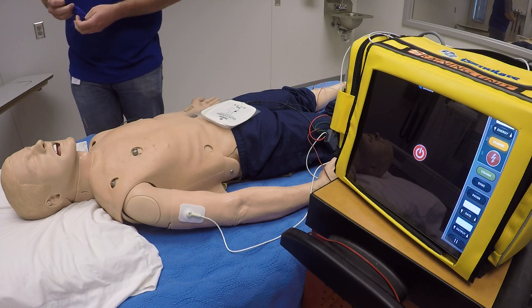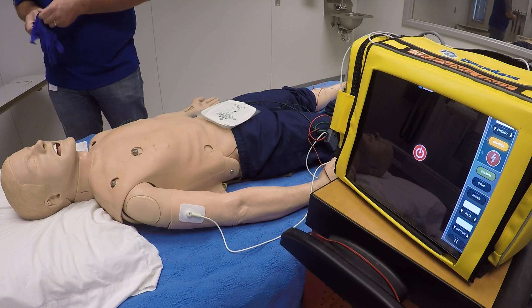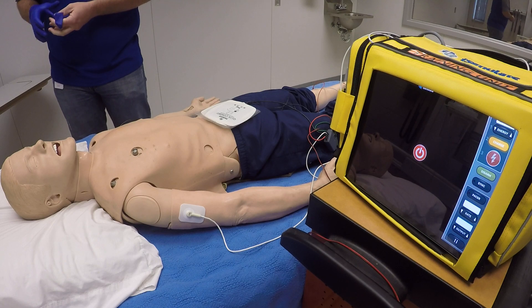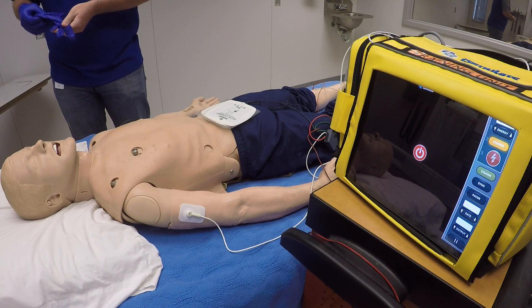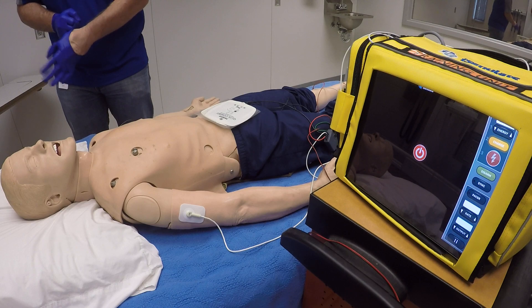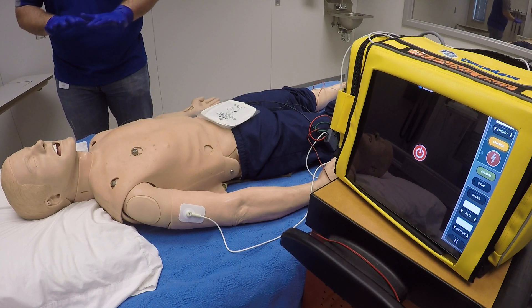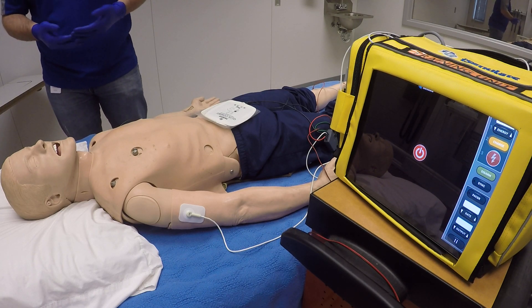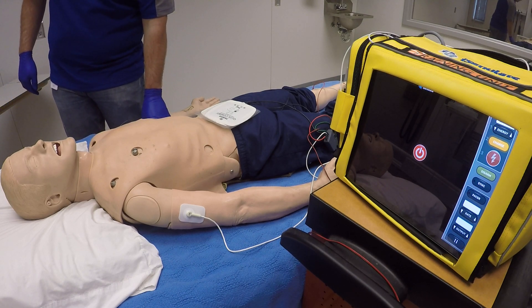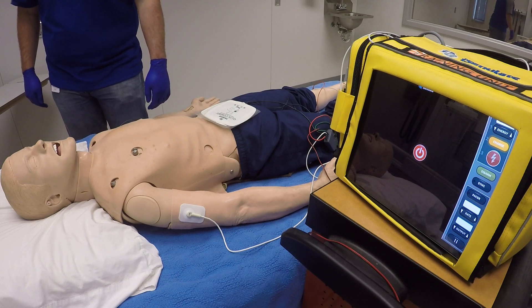We can consider the need for medication to sedate the patient — Versed or Valium or whatever your protocol has. Also, if the patient's SPO2 is less than 94, we want to make sure we have oxygen on the patient. Of course, we have our PPE on. Make sure we have a good patent IV and oxygenation if needed.